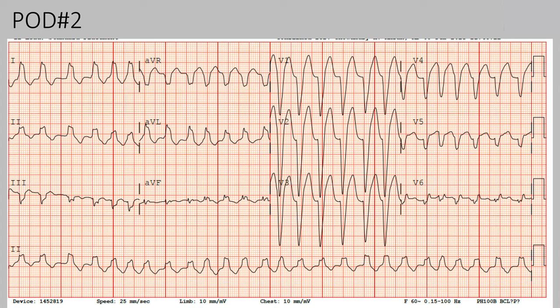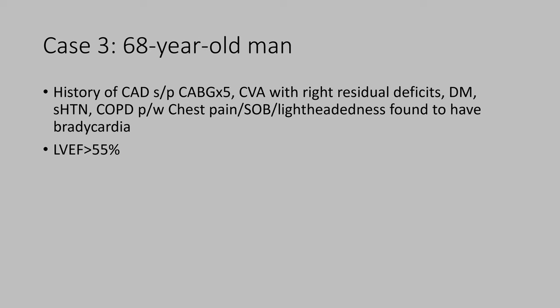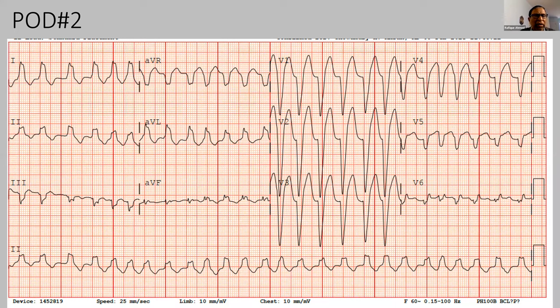Okay. Routinely, they will try amiodarone. That's the way they do it. Yeah, so that's what we give. And also give Lasix. Post-op CABG. Can you go back, please? Can you see it now? Yes. So what are the working diagnoses? AFib with left bundle. Yes, because it is irregular.